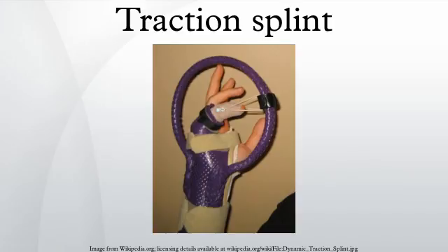Their use is common in prehospital care. Evidence to support their usage however is poor. A dynamic traction splint has also been developed for intra-articular fractures of the phalanges of the hand.